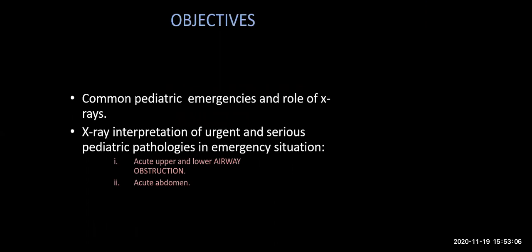I'm happy today to present emergency pediatric imaging. My objective today will be to talk mainly about the common pediatric emergencies and the role of X-rays in diagnosing most of the serious emergencies in pediatric imaging. I will mainly talk about the interpretation of urgent and serious pediatric pathologies in emergency situations.